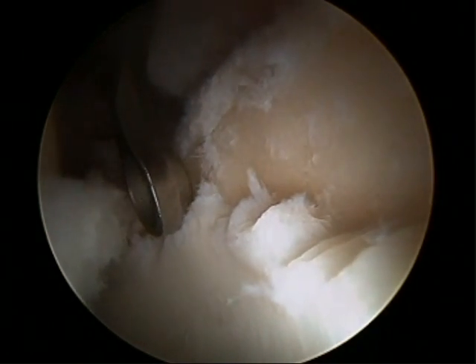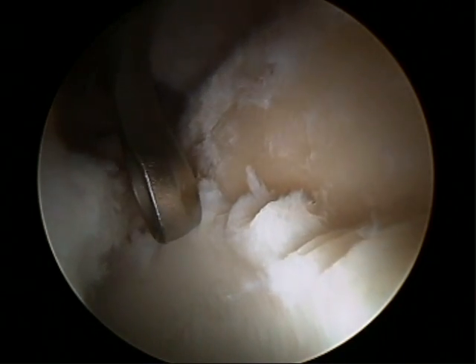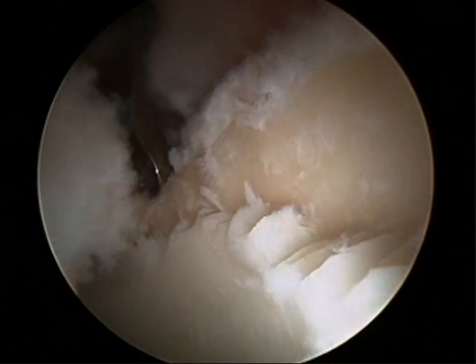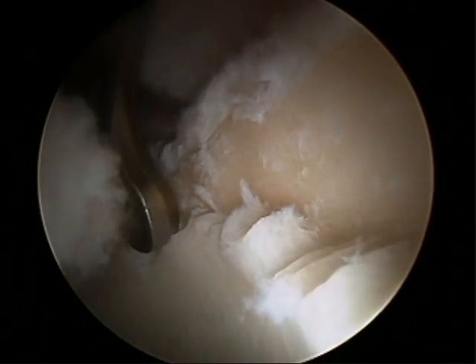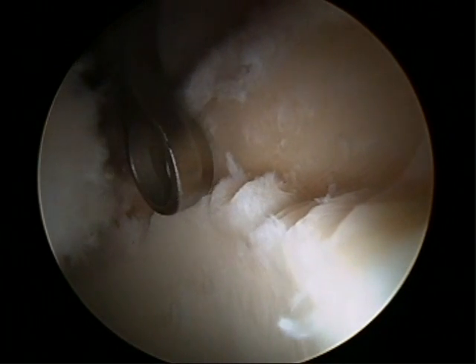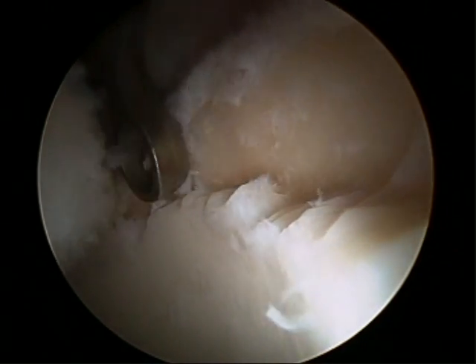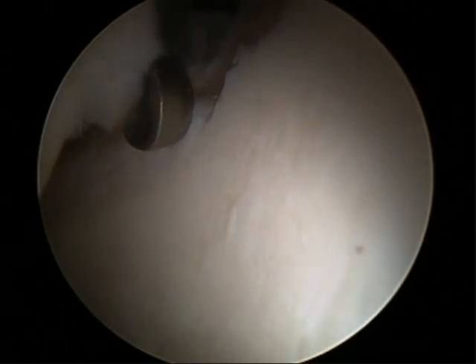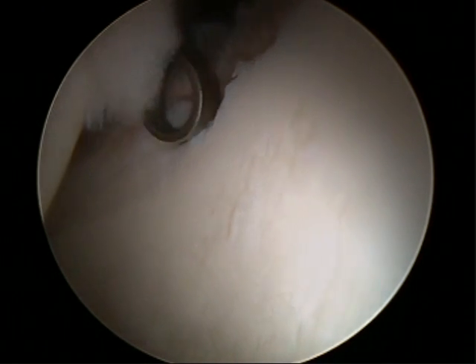Here we're going to complete the trimming of the torn and delaminated portions of the cartilage. We essentially trimmed the delaminated cartilage back to the point where the cartilage becomes stable again using a ring curette and a shaver, creating a margin of stable cartilage. Many times this coincides with the amount of rim trimming planned, and in this case it looks like it will coincide.